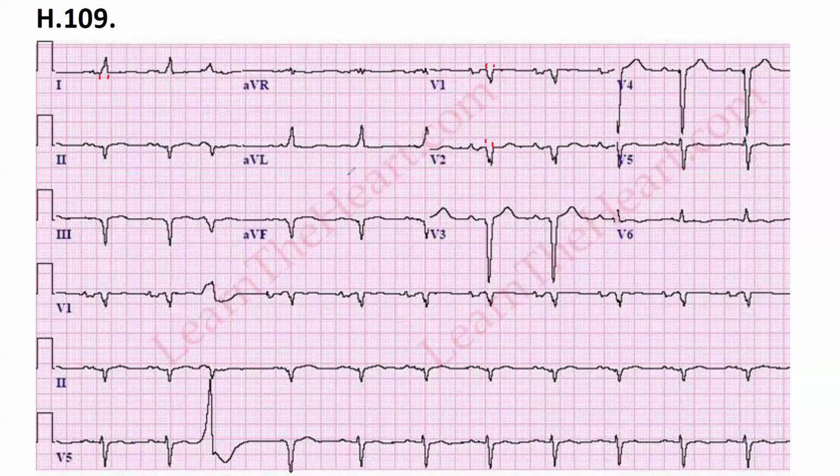Now, what does it mean? That the ventricles are not contracting at the same time. Like it might be some kind of hypertrophy. Well, hypertrophy can elongate the QRS, but not too much. If you do have a wide QRS, especially if you know that this is supraventricular, you have to assume that you do have a problem inside the ventricle, so you have intraventricular conduction abnormality, meaning you can have right bundle branch block or left bundle branch block.